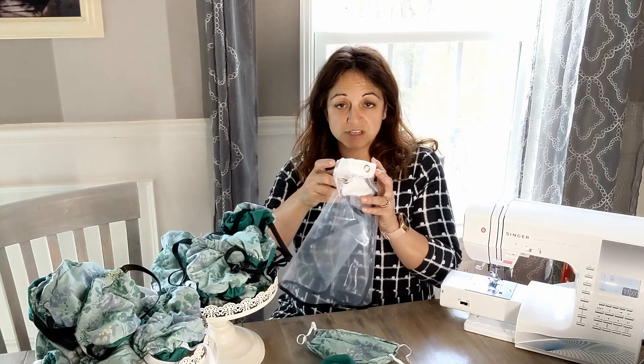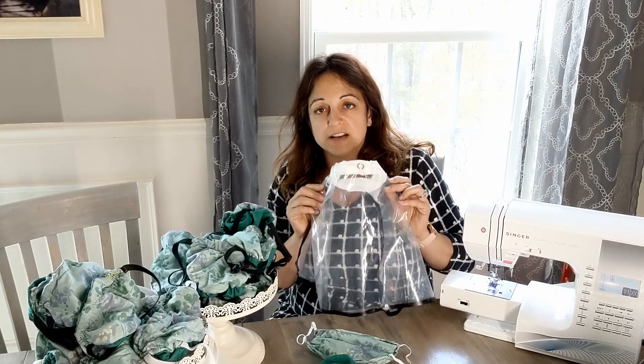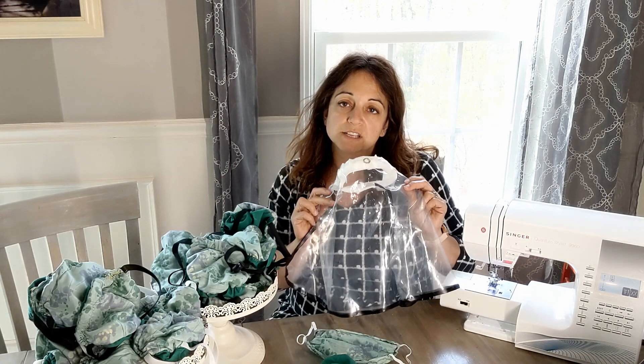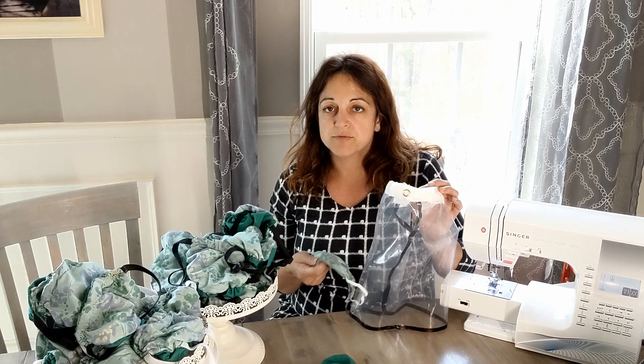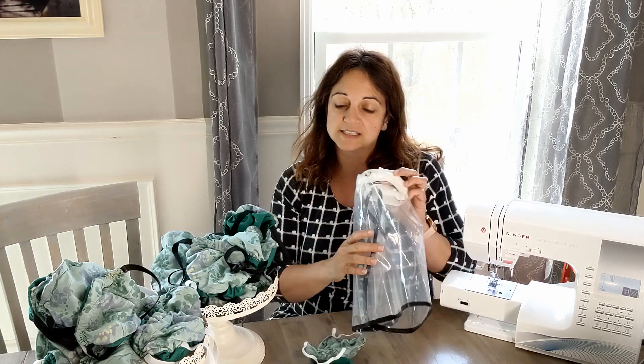Anybody wearing a fabric mask of any type absolutely must have a face shield over the mask. These are face shields — I made a quick tutorial on how to make them out of shower curtain or clear vinyl, a quick and easy design and they're pretty comfortable. Whether you have one from a 3D printer or commercially available face shields, if you're wearing a fabric mask, you must have a face shield over it to stop the patient's droplets from getting onto your mask. For close-contact patient care, you also want goggles and anything you can do to stop particles from getting into any of your mucous membranes.